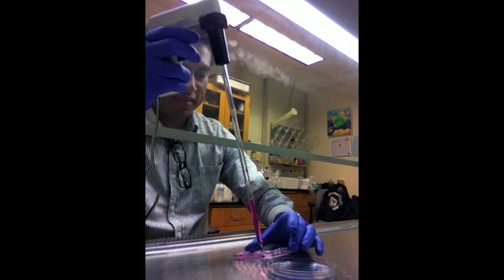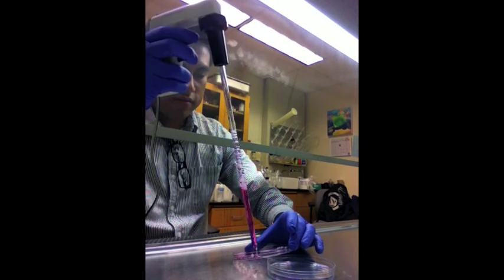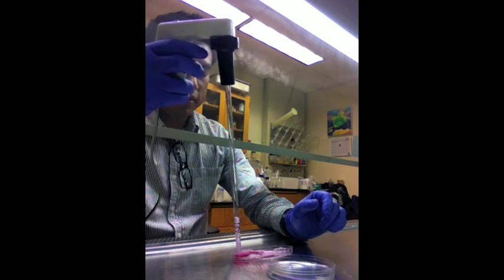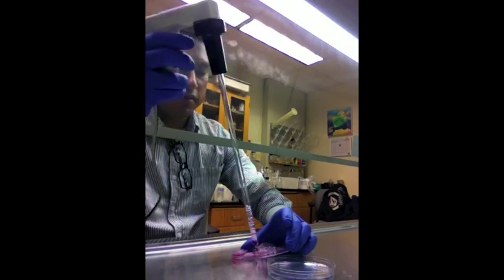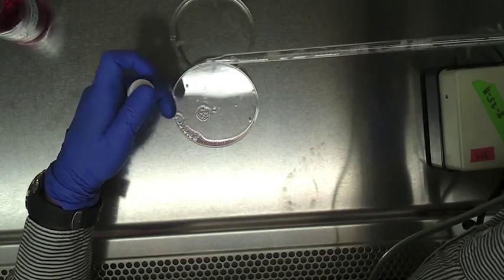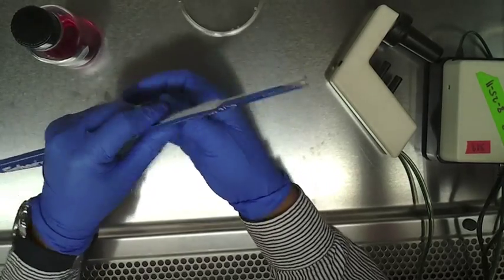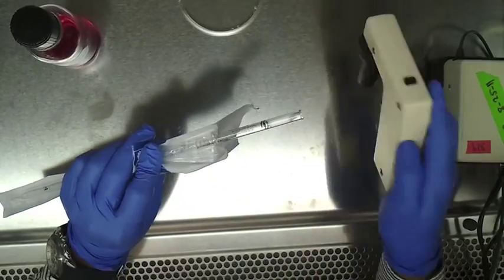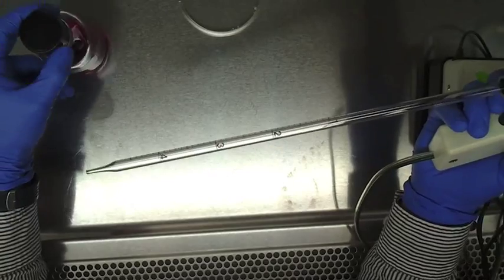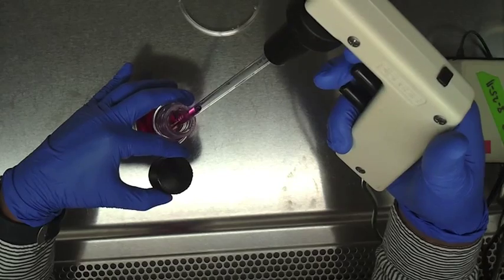The embryoid bodies have been collected and added to a 15ml conical vial. Fresh media is then added to the conical vial to fill up to 10ml.